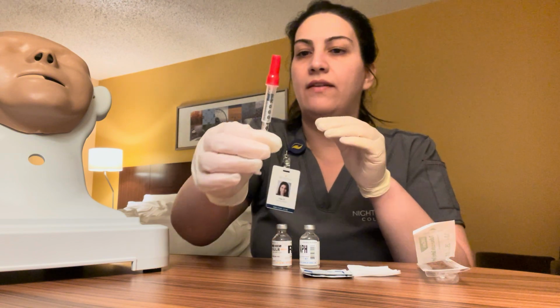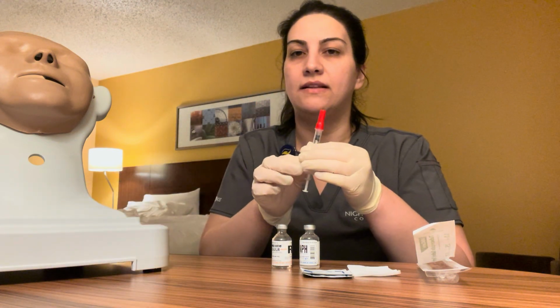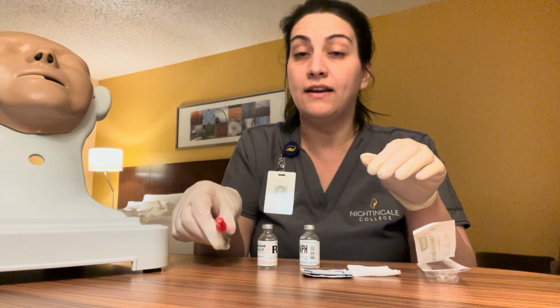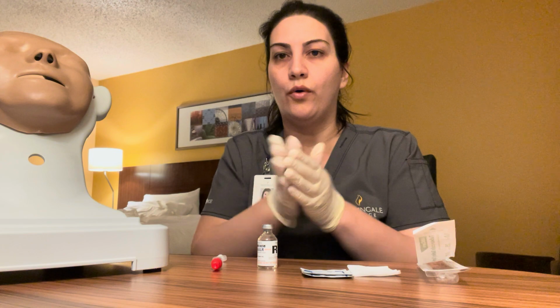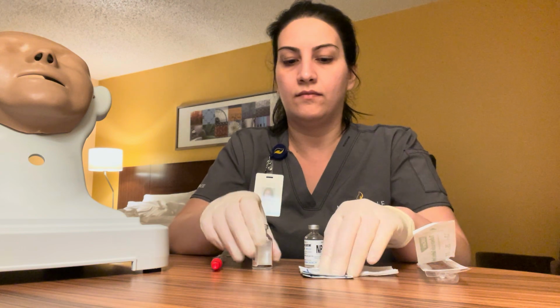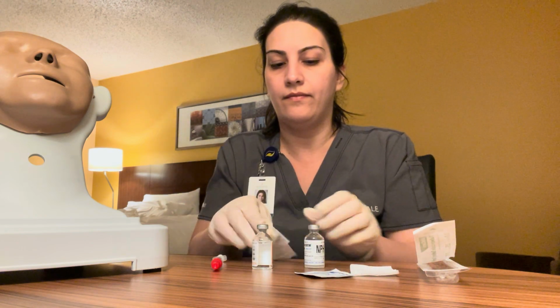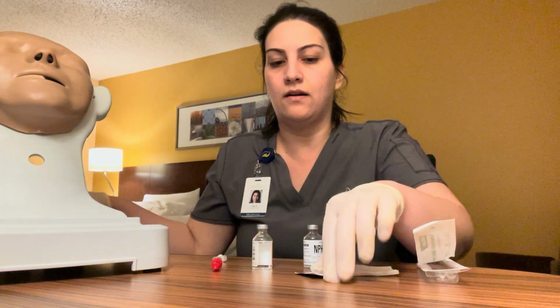Eight units of air. Nurse and I verify against the MAR, 8 units of air. Next, before I do so, I want to roll the medication vials. And I want to clean off the tops of the medication vials.